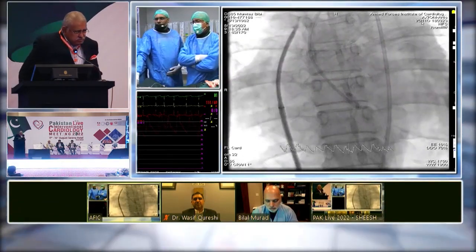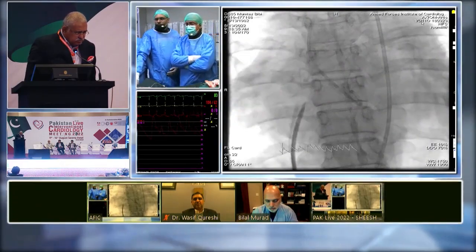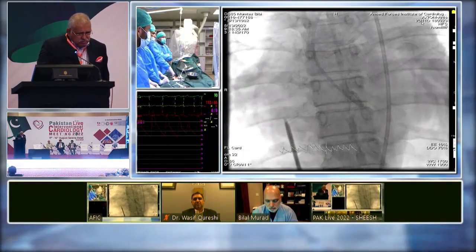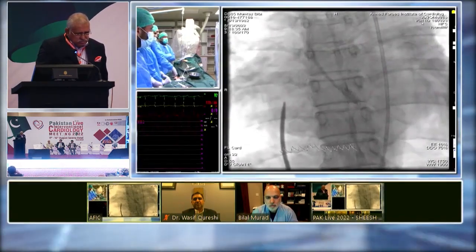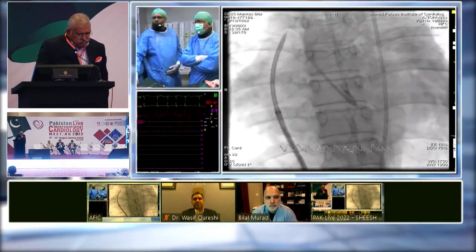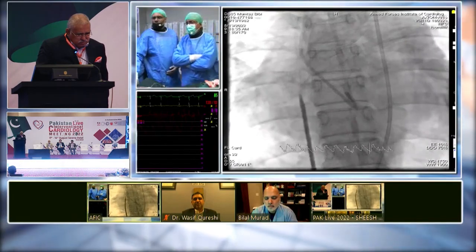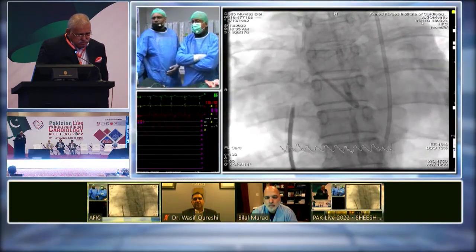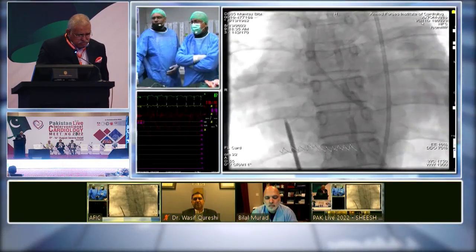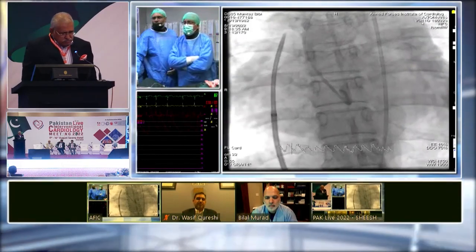If you want, the marker I use is the subcarinal angle. When you talk about X-ray, what are signs of enlarged left atrium, mitral stenosis? Splaying of the subcarinal angle. So the subcarina is where we say the left atrium is. And so we just brought it down in AP, and we bring it just below the pigtail, which is marking the aorta.